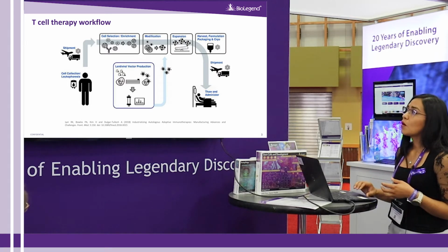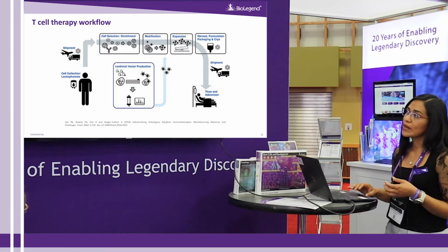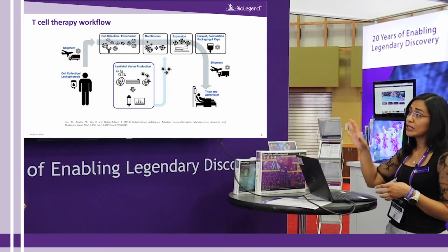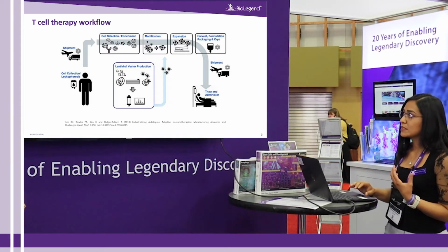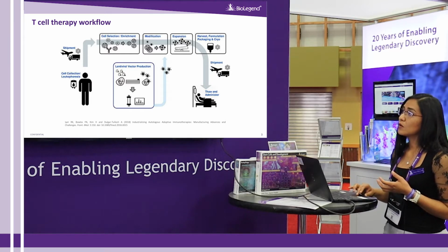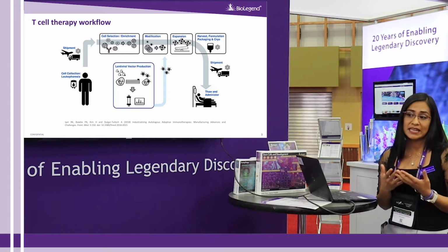Then you have to freeze the cells again to be shipped back to the hospital to be reinfused into the donor. So based on this workflow, we are trying to develop different tools that are going to help to keep the cells alive. So in my poster, I'm going to present some data for the cryopreservation solution, and today I'm going to present data about a product that is going to support the expansion of the cells.